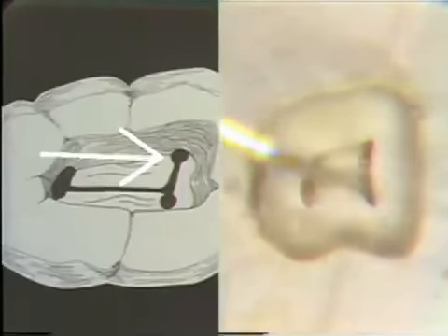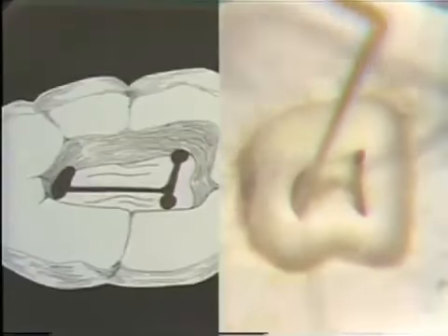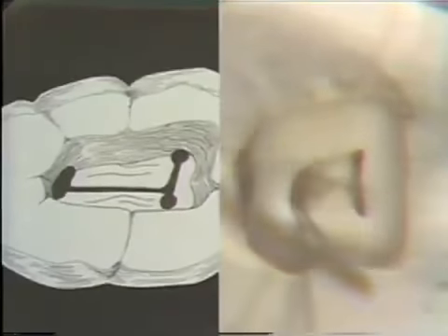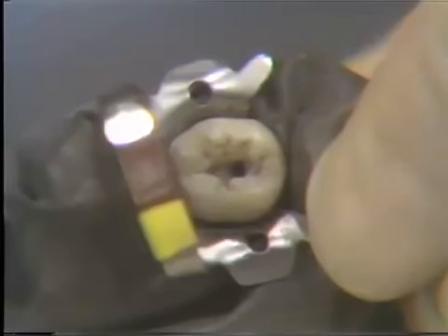but almost directly mesial from a big distal canal. Now in this case, the distal canal actually has two separate canals, which we can find by probing in one direction and taking the probe out and probing in another direction. Make sure in mandibular molars that you check the distal canal to make sure that it's a single canal instead of two smaller canals. When you find the orifice to the canal, then you have to have the proper angulation to get your file into the canal.